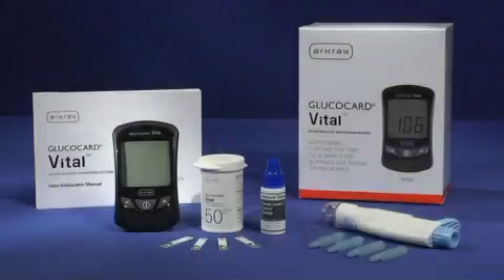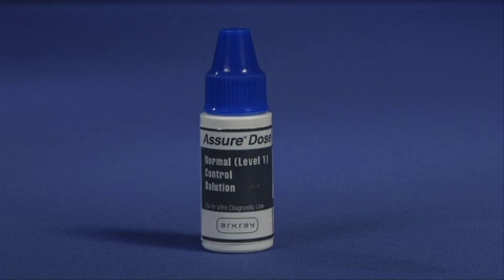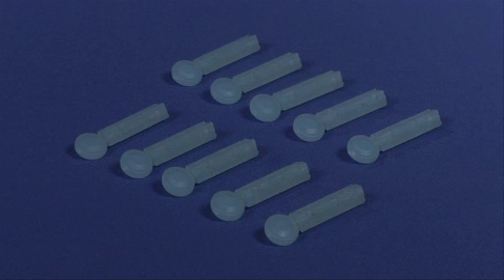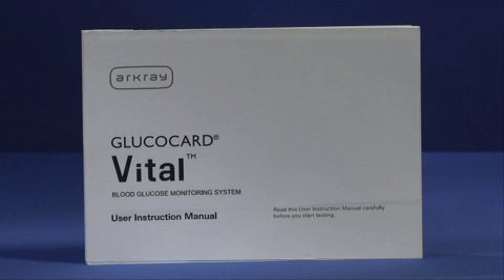Your Glucocard Vital System includes a meter with one 3-volt lithium battery already installed, 10 Glucocard Vital test strips, a sure dose control solution, a lancing device, 10 lancets, a carrying case, a log book, and a user instruction manual.